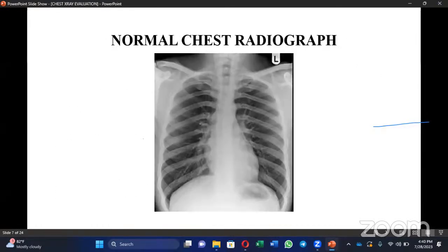Now let's look at the collimation, which is C. We've talked about the area, so let's look at C, which is the collimation. We should be able to see evidence of collimation around the image. However, this image is a processed image, okay? So we've cropped off the area of collimation, all right? And that's what is mostly seen on our images, because most of our images don't come out raw just like that. They come out processed or manipulated. So you have all the evidence of collimation chopped off.